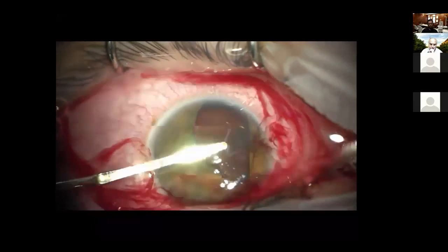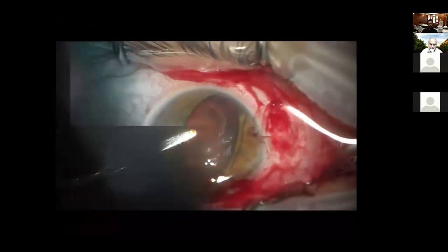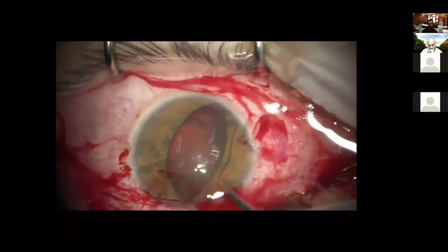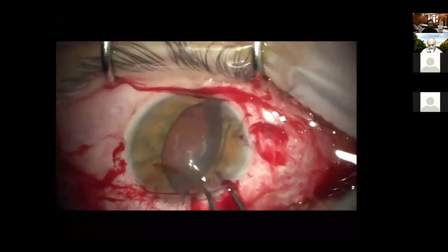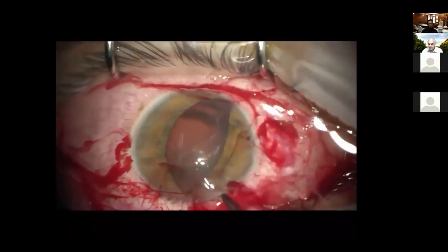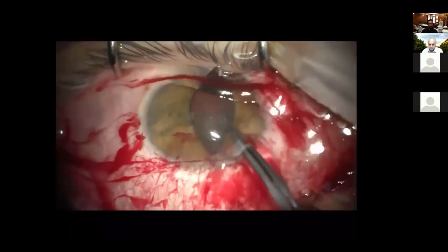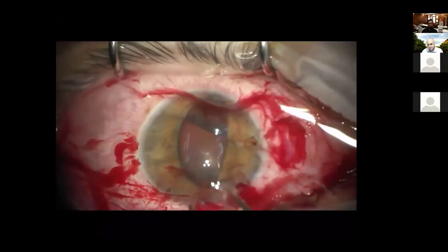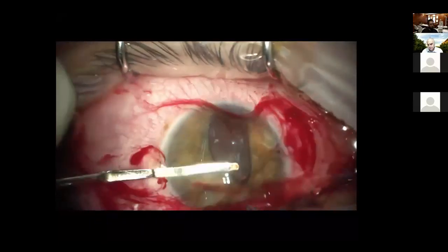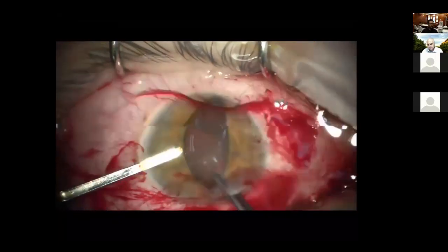It's better to prolapse most of the nucleus and most of the lens in order to grasp it. And you simply try to grasp it with the two forceps. Is it thicker than the normal ICL, the original ICL? Yes, actually it is, but it's still quite thin, and part of it is torn here while I try to grasp it. So I'm trying to grasp it from the center as much as possible in order to have a strong grasp on it.